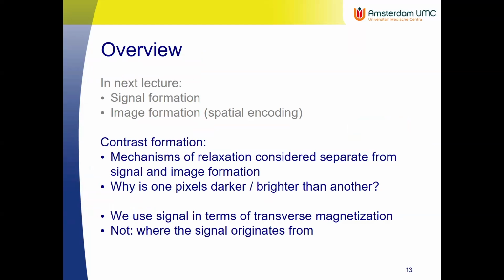Yeah. So what I'm going to talk about now is the contrast, how the main knobs, the echo time, the repetition time, influence the signal and how you produce the different contrasts with that, the T1, T2 weighted images. That will be on my next slides.